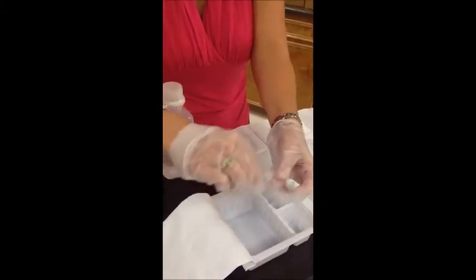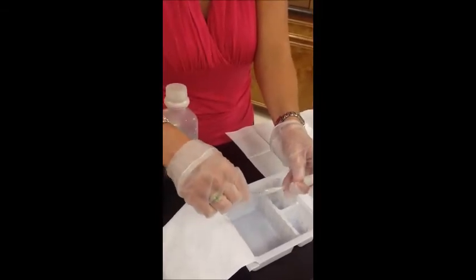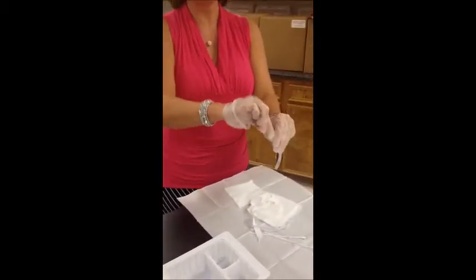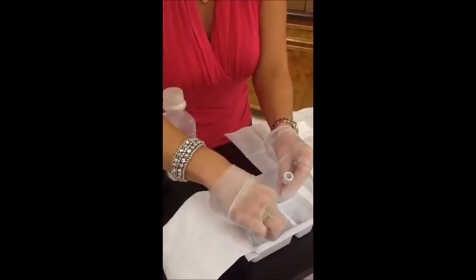Clean it off. Make sure you get all the little crusty stuff off. You can even take the brush up this way. What we don't want to see is for you to step over here over your sterile field and be giving it this, flicking stuff everywhere. Really low and controlled, okay? When you're done with the brush, you can lay it down.